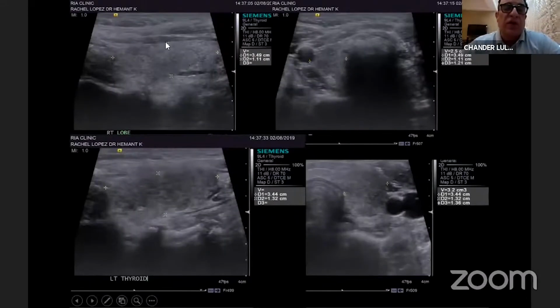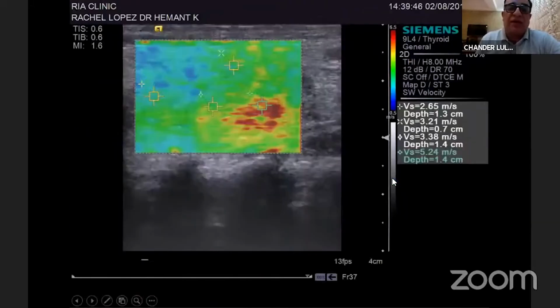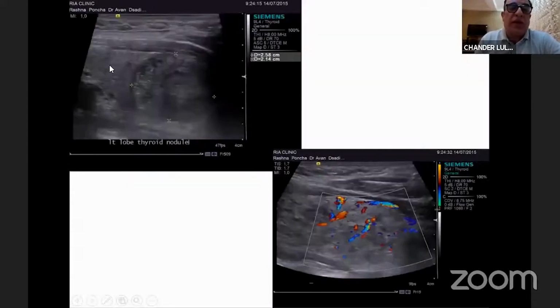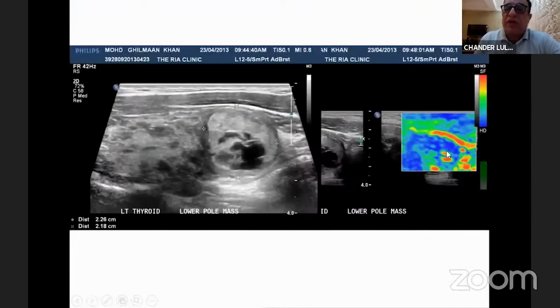This is a thyroid with ill-defined hypoechoic areas suggesting thyroiditis. It can be extremely vascular and it can be stiff on elastography as is seen here. And there will be areas which are very hard and areas which are soft and not so hard. And that's a nodule formation in a background of thyroiditis. So this is again thyroiditis with the nodule formation here, which is complex cystic, peripheral vascularity, looks benign, spongiform appearance, and the stiffness is in the periphery.